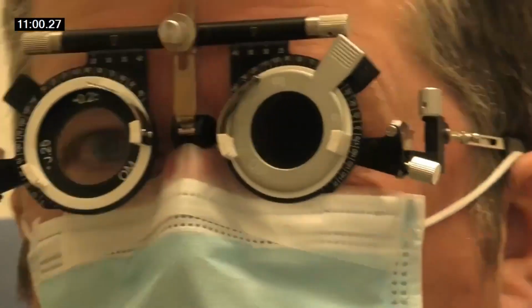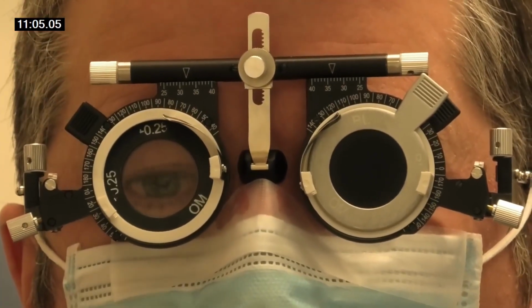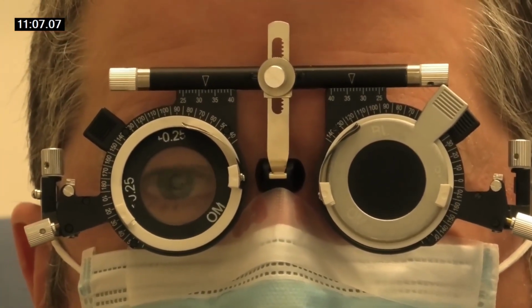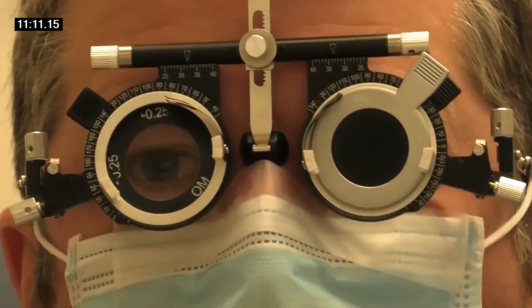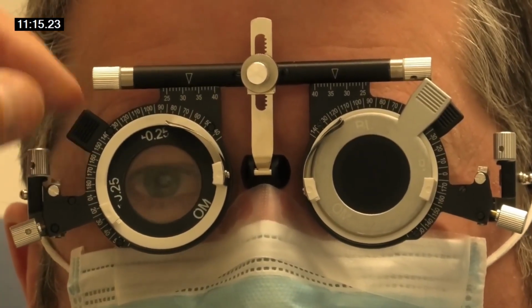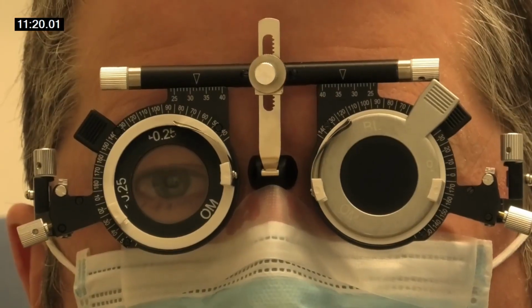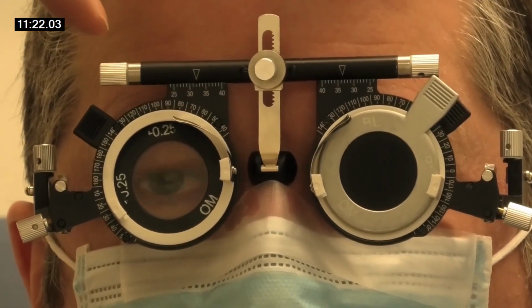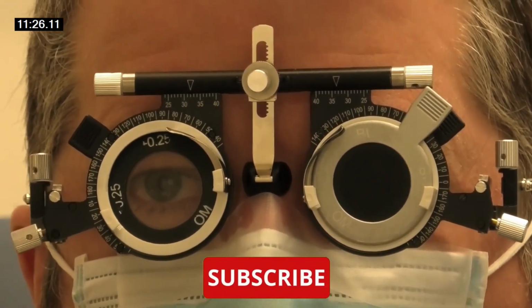So now we do the other eye. I mean, we could spend ages on this trying to find out what the sphere was, couldn't we? We could do the +1 test, we could do the duochrome, we could spend absolutely ages. However, that sphere is determined binocularly, isn't it? When we go to the binocular phase, there's no point spending ages at this phase. We've done the cylinder.